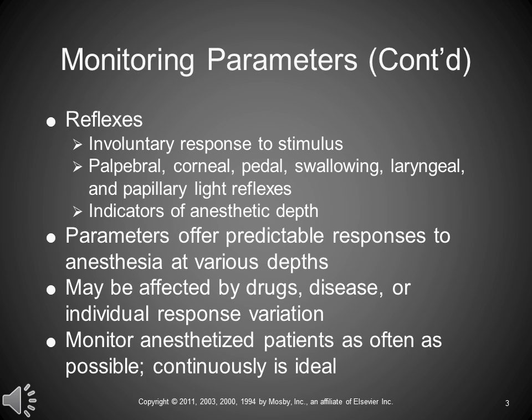We are, in fact, when we monitor patients, monitoring two separate yet interrelated things. We are measuring by using vital signs and physiological parameters how that patient is doing physiologically. By monitoring reflexes, we're going to monitor how that patient is doing as far as stage and plane of anesthesia.